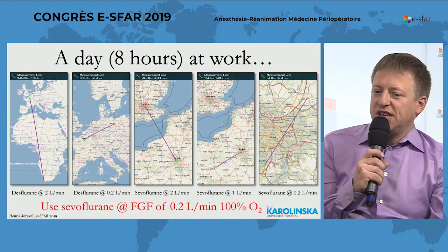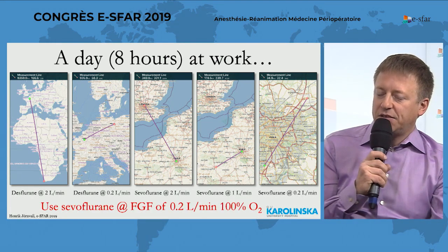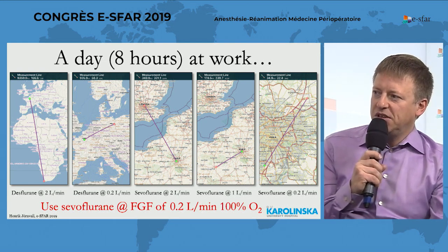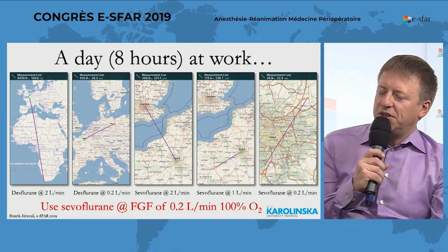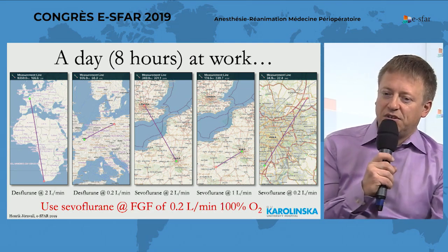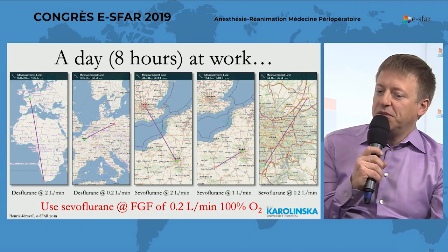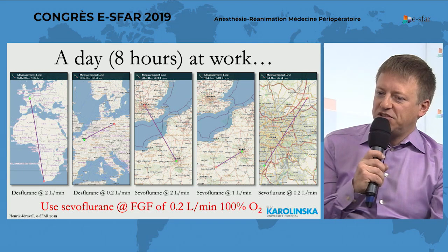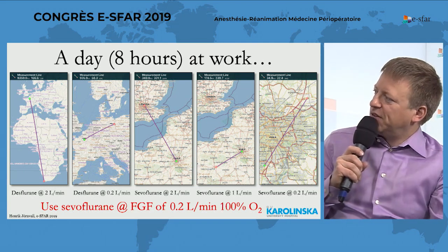So my conclusion is to use sevoflurane at a fresh gas flow of 0.2 liters per minute with 100% oxygen. And you will reduce your carbon footprint, you will reduce your cost, you will increase the patient's safety, and the teaching environment will improve also. Just benefits. But don't try to wake the patient up. When you want to wake the patient up, you have to go to high flow.